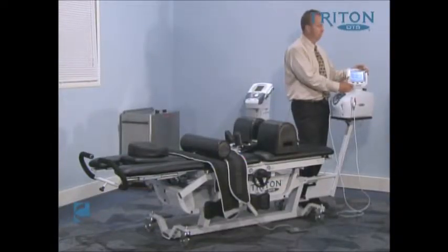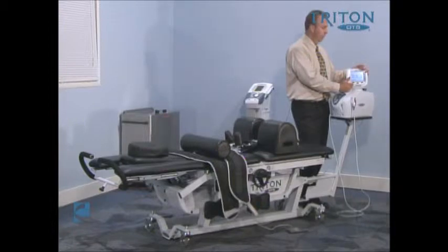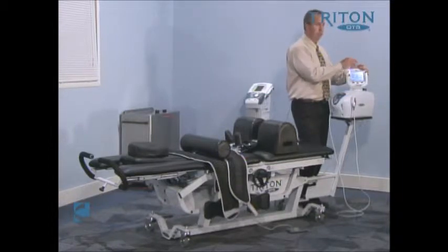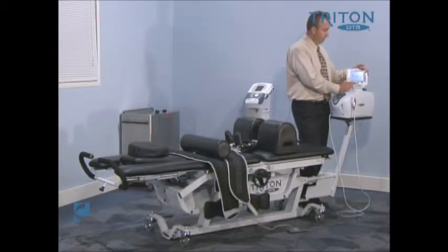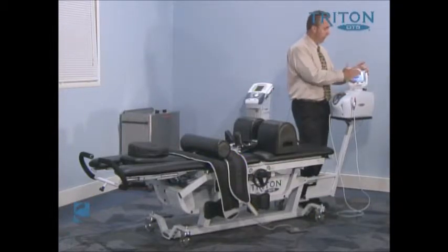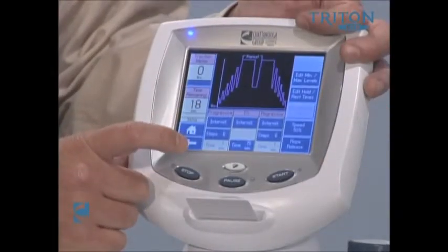We can also edit the rest and hold times. During an intermittent traction we have an opportunity to adjust the upper level of intensity and determine how long we would like to hold that intensity, as well as how long we would like to spend at the lower intensity. If you choose a stepwise fashion for the progression, we can also manipulate the amount of time spent within each one of those steps, and similarly for the regression phase.